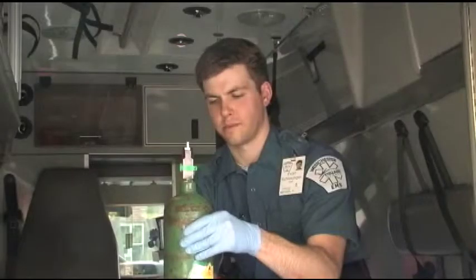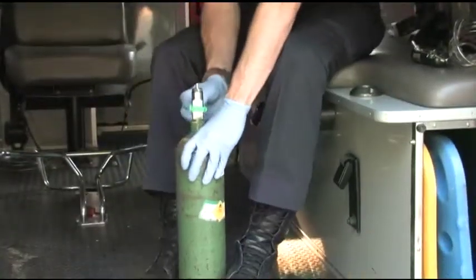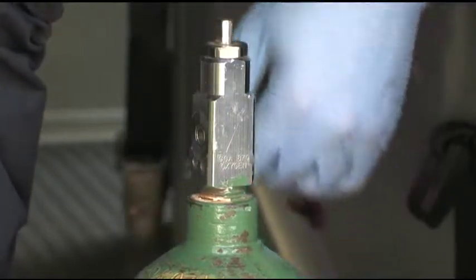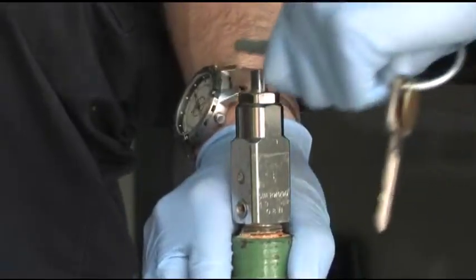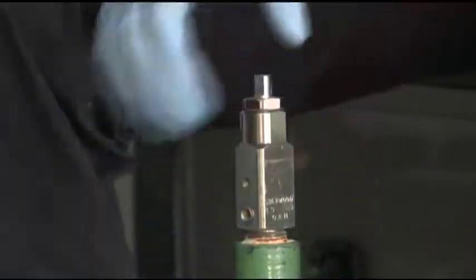Now that you have inspected the tank carefully, you are ready to assemble it. Here are the steps that you should follow. To reduce the risk of injury, place the cylinder in a secure, upright position. Remove the plastic seal or cap protecting the cylinder outlet or valve. Keep the plastic washer found in some setups. Quickly open and close the valve. This will remove any dust or debris from the valve assembly.